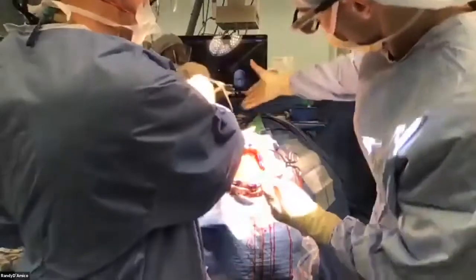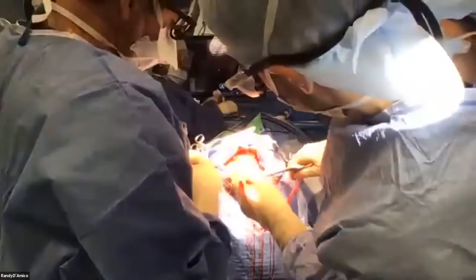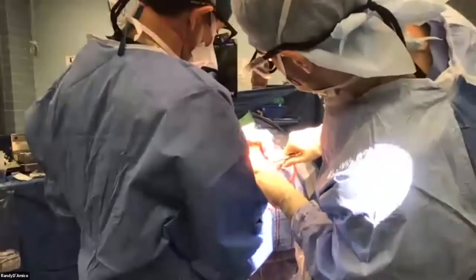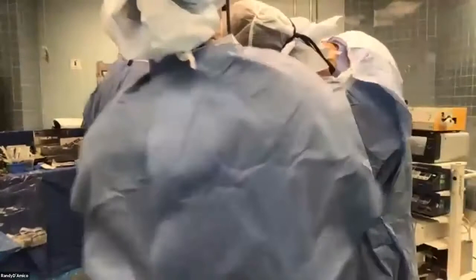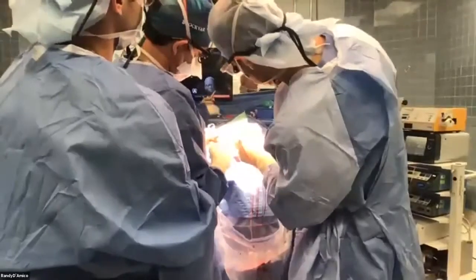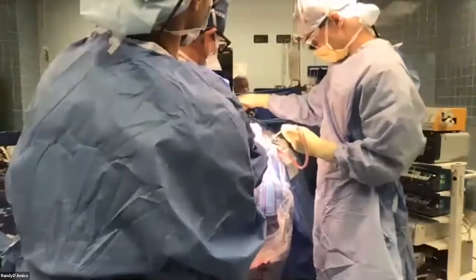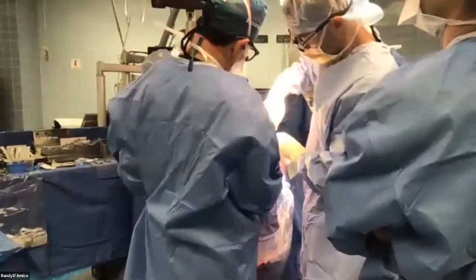Thank you. Okay, let's put the foot plate on the drill. Josh, when I say so, could you bring the head up and the table down, please? Can you move this stand back? I'm going to stand right between them so I can get my headlight on them. Head up now? Keep moving. Just move the whole thing. Yes, head up now. Table down. Thank you. The drill back, please. I usually just run it and turn it there.